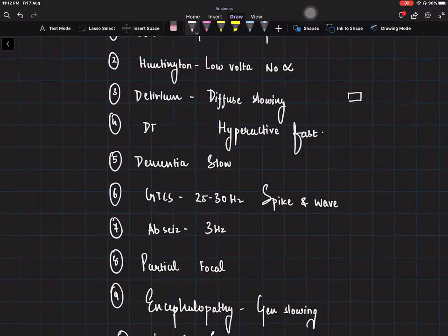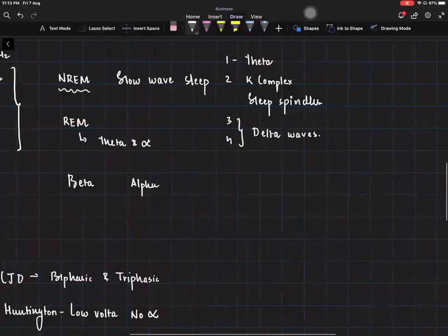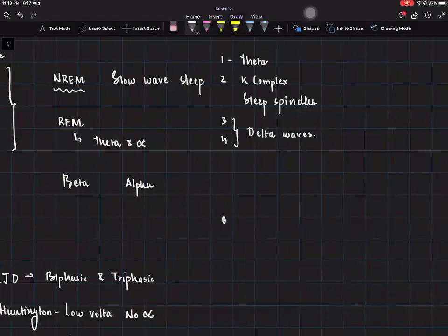What are the techniques that we usually use in an EEG to make sure that we get the pathology? We cause the patient to get seizures by throwing light, blinking light, and hyperventilation. When we give light, what is it known as? Photic stimuli.